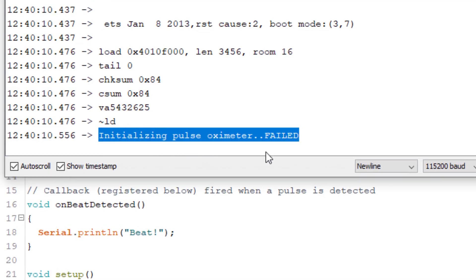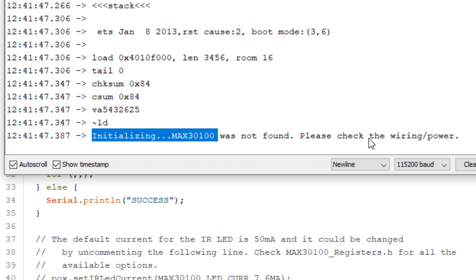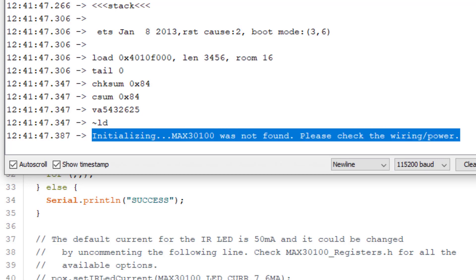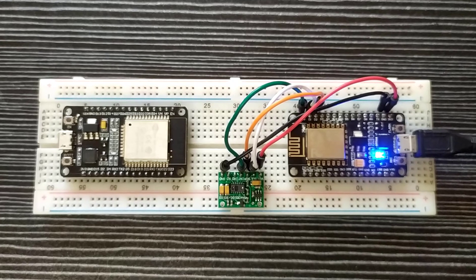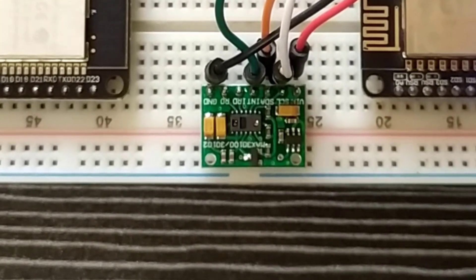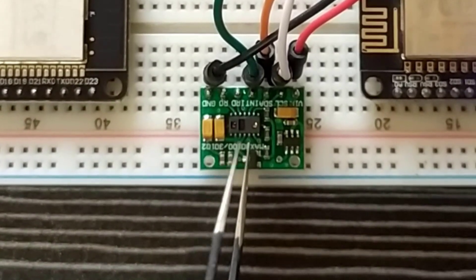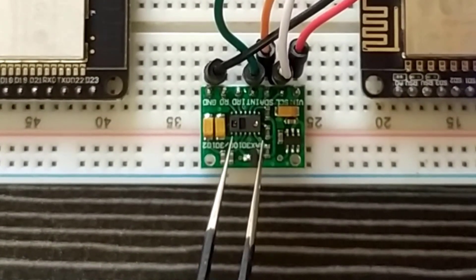We are getting responses like 'Initializing pulse oximeter... failed' and 'Initializing... MAX30100 was not found, please check the wiring or power.' Since the sensor cannot communicate with the microcontroller, it will never receive a command to read the pulse and oxygen levels. Thus, the red LED never glows.